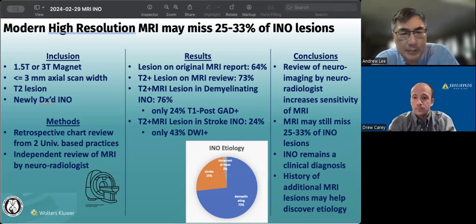And shouldn't the demyelinating lesion that's acute be enhancing, or same problem? I think it's the same problem. We'd like to think that the slices are perfectly correlated on your T2 and on your T1 post contrast, but they might not be perfect, and so you may miss it.